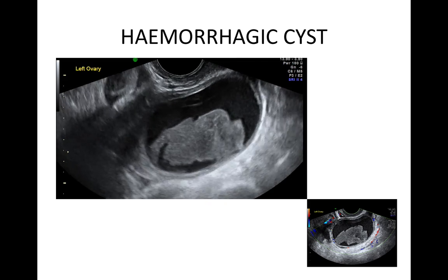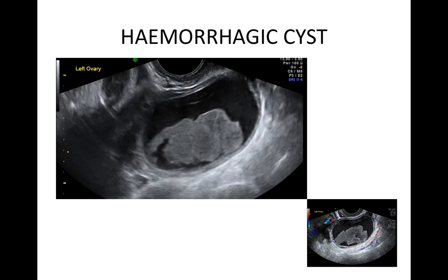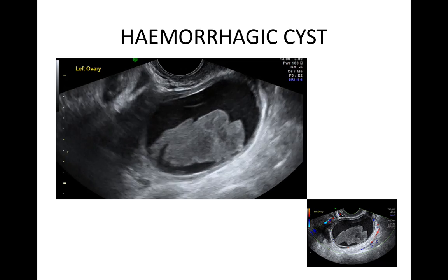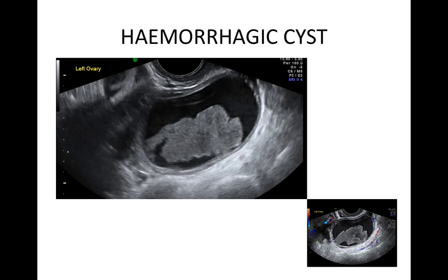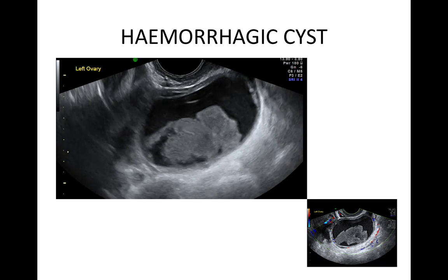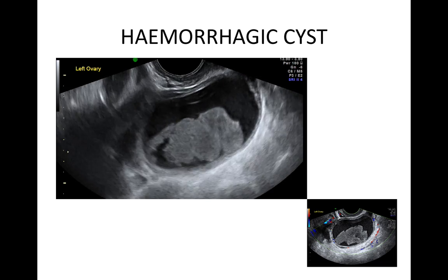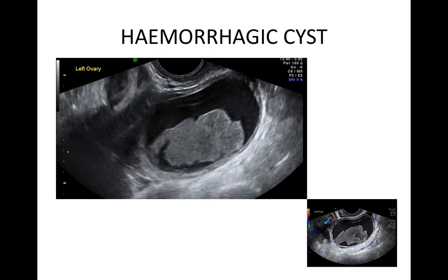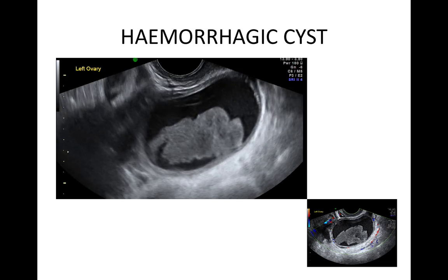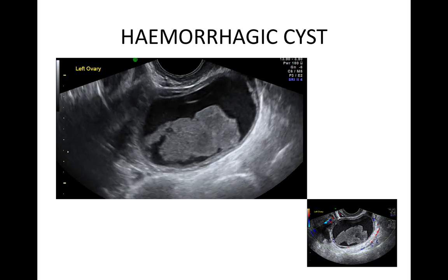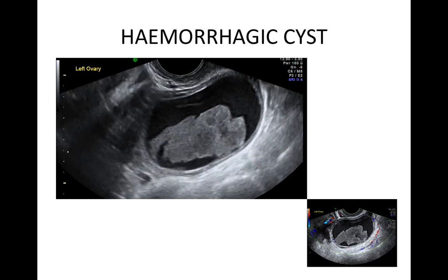This functional cyst, a hemorrhagic cyst, is unilocular with mixed echogenicity. You can see some clot adherent to the internal cyst wall. It wobbles on pressure with the ultrasound probe. The clot is not solid material and there is no internal vascularity, so this cyst is unilocular, not unilocular solid.